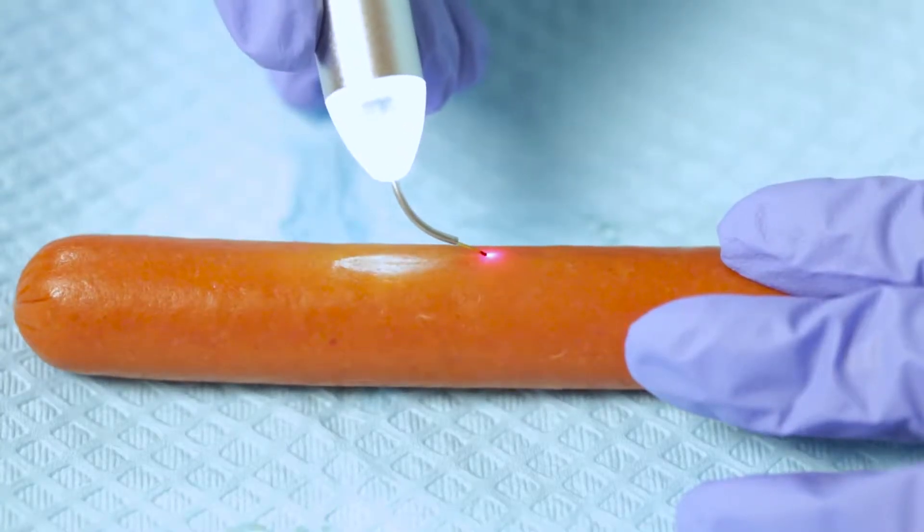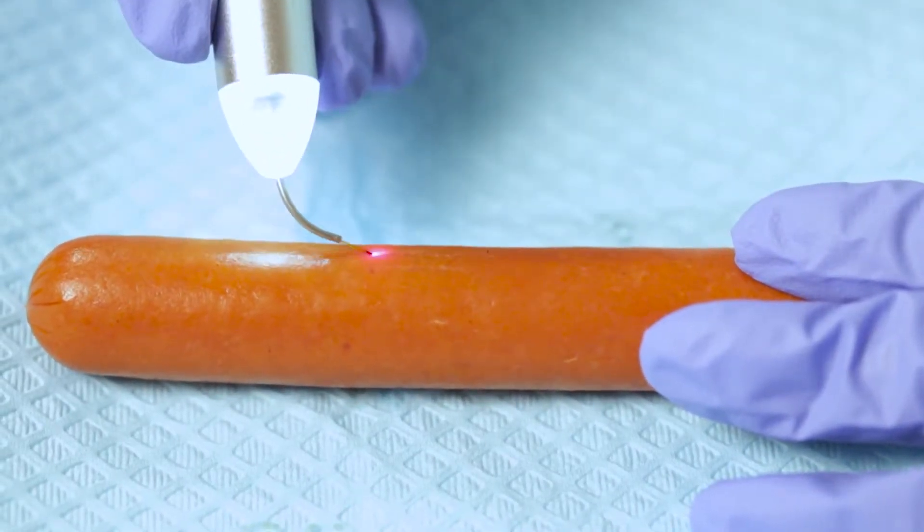I wanted to go over a few more tips when using your Gemini. It is very different than using your electrosurge. With your electrosurge, it is side and end cutting. Soft tissue lasers are more end cutting. With the laser, if I try to go on the side, I'm not going to cut.